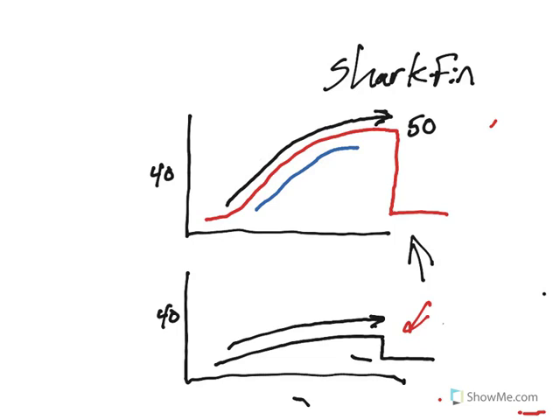Whatever. So in this case down here, you can see that your patient is not doing very well with this bronchospasm. You can tell they're not exchanging a lot of gas, and that lack of exchanging gas tells me that my patient is probably in some trouble, and that's why I need to get bronchodilators on this patient. So these patients are absolutely perfect for bronchodilators.